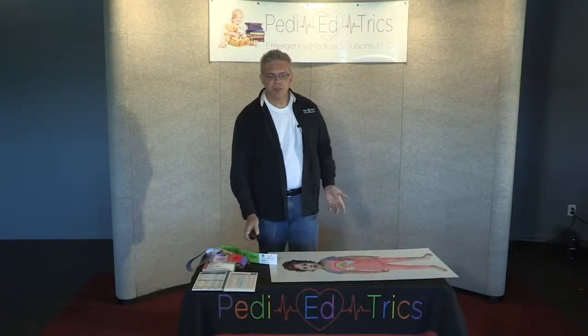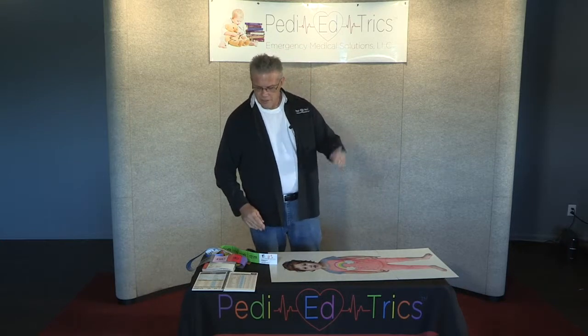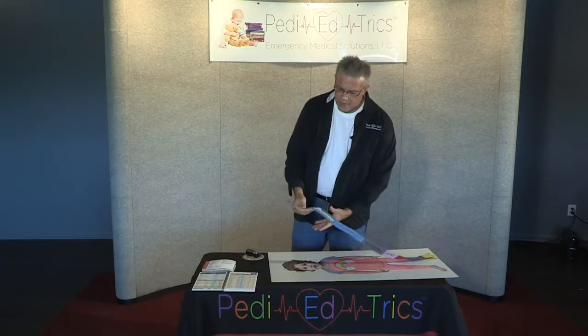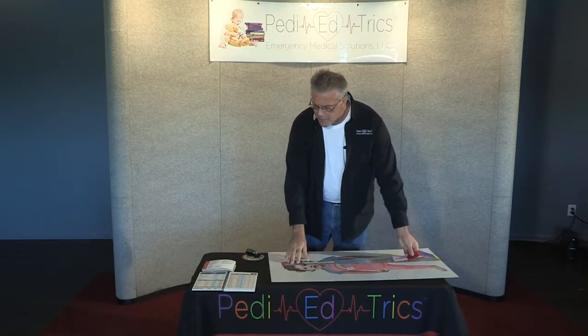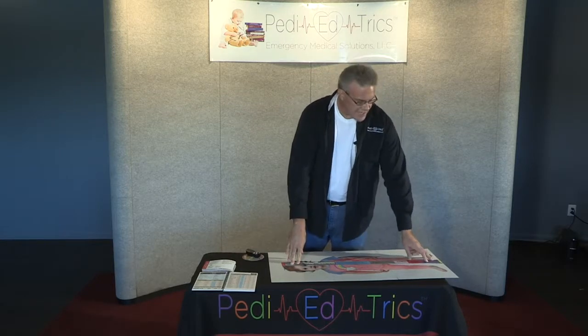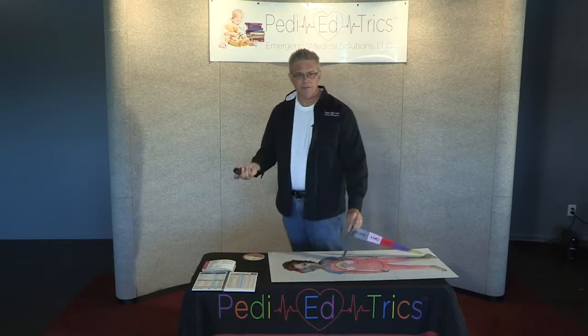When it comes to Handtevy, remember, Handtevy does color by age. So when it comes to this child, we're going to take the tape if we don't have an age, and we're just going to measure red to the head down to the heels. And we're going to see that this child on Handtevy is a purple.